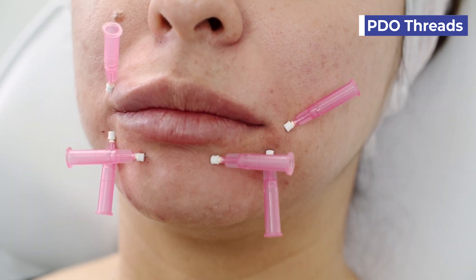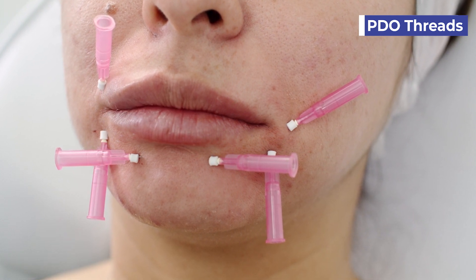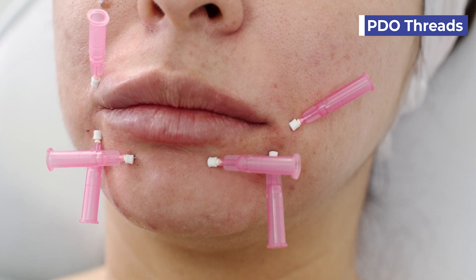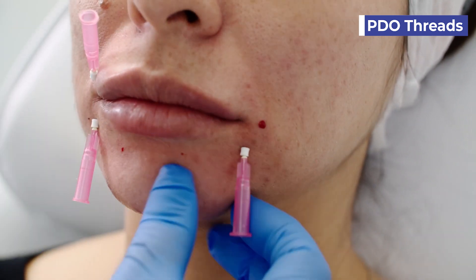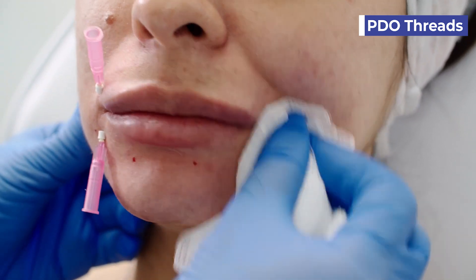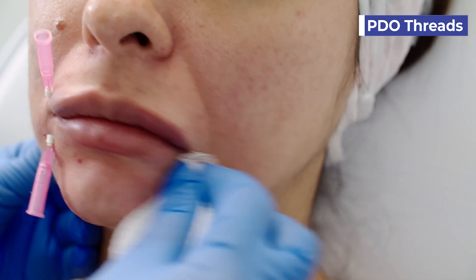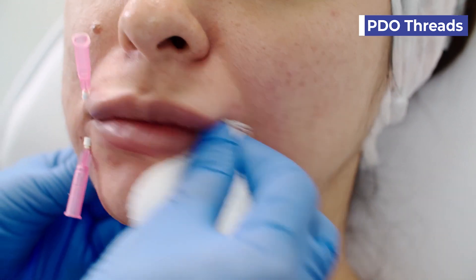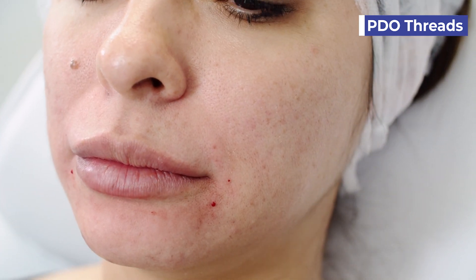I put some PDO threads that are screws or twists — monofilaments — in order to give a little more structural support and smooth this area in conjunction with the prior fillers already placed. You can see they're very tiny needles; you may get some little droplets of blood but that goes away. People rarely bruise from this, so it's very minimal downtime.